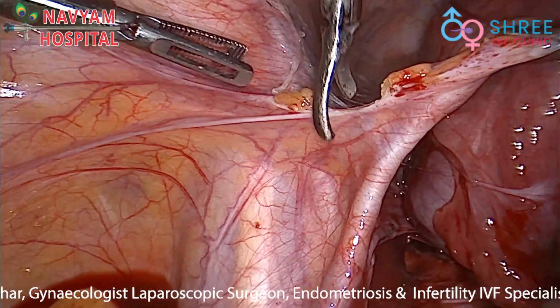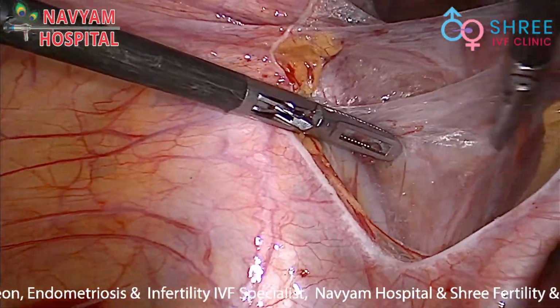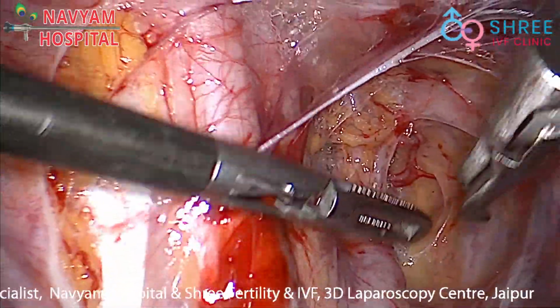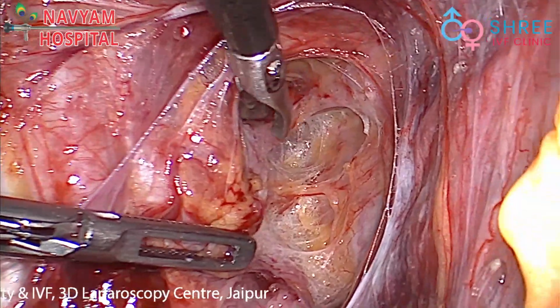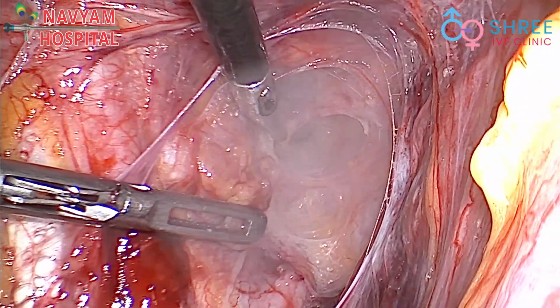The IP ligament was stretched out medially, and the internal iliac artery, uterine artery, and ureter were well identified. The uterine artery was ligated at its origin to reduce the vascularity of the uterus.